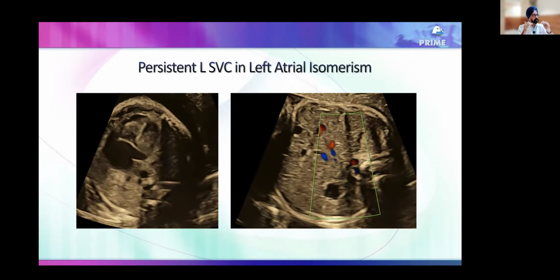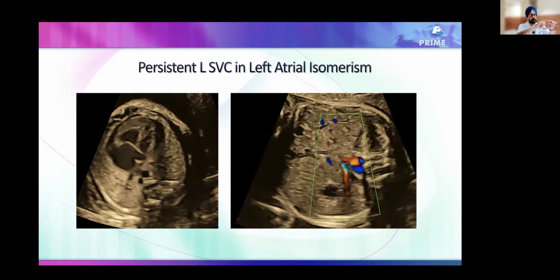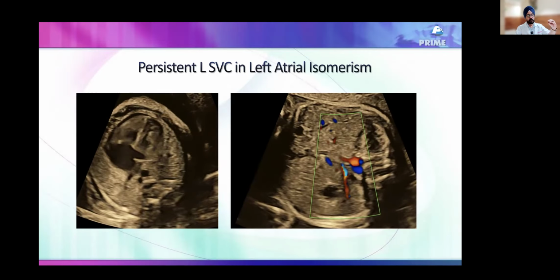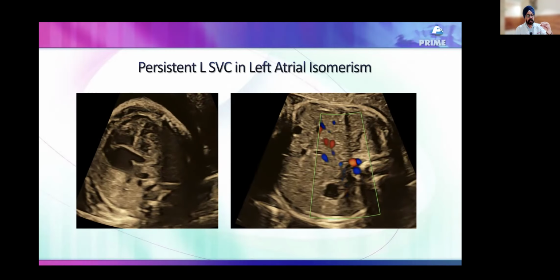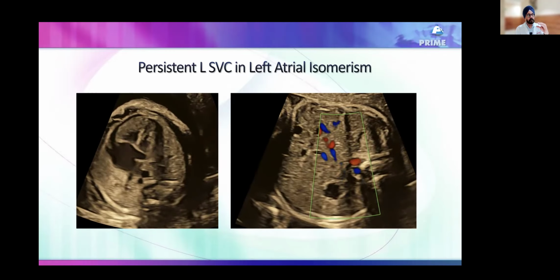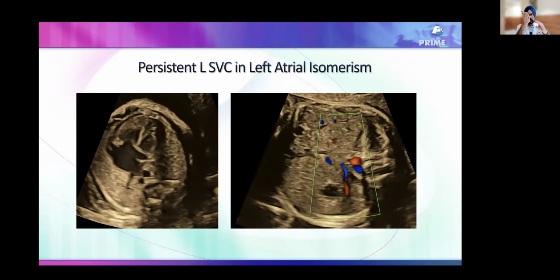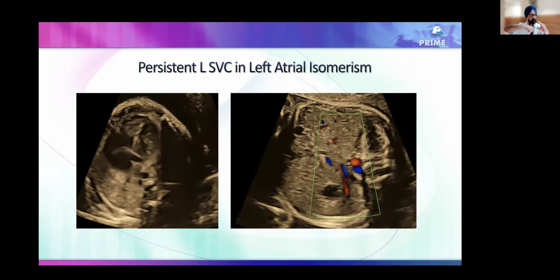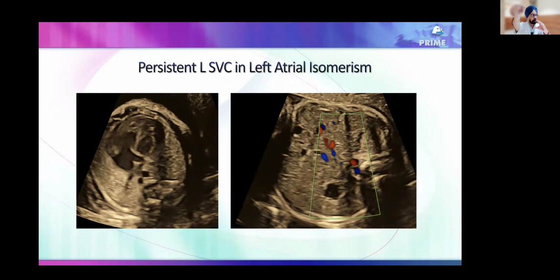If you remember, the IVC leaves the aorta. Now, if you see the sagittal view, the IVC comes along with the aorta from caudal. Then when it enters the liver, it leaves the aorta and makes an angle and goes anteriorly because the RA is an anterior structure. So it goes anteriorly to enter, right?